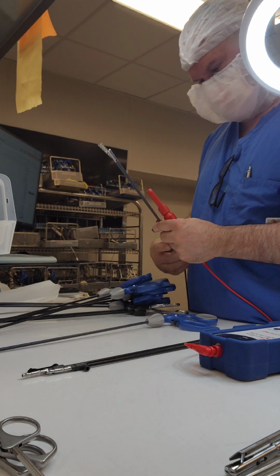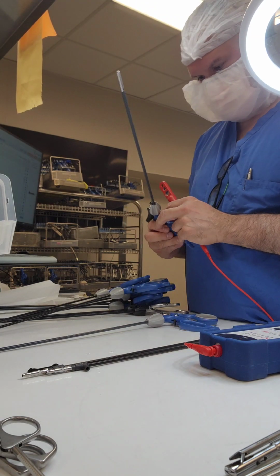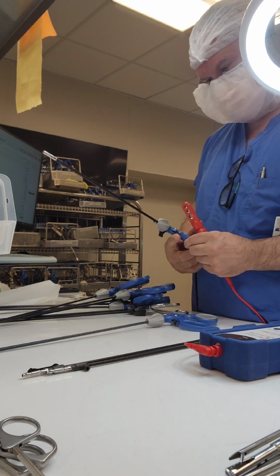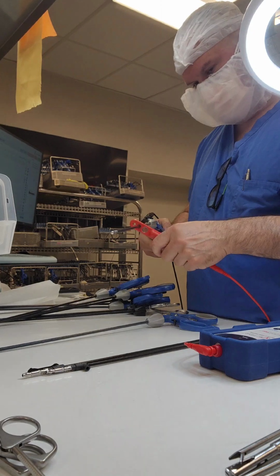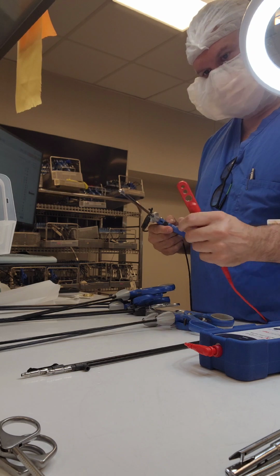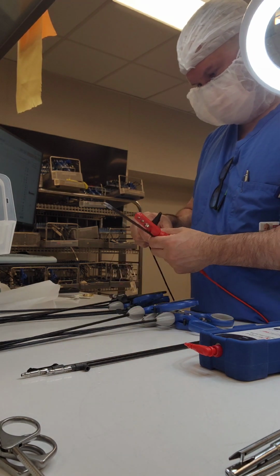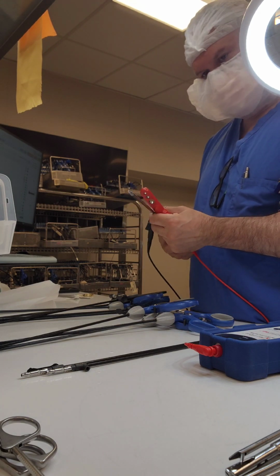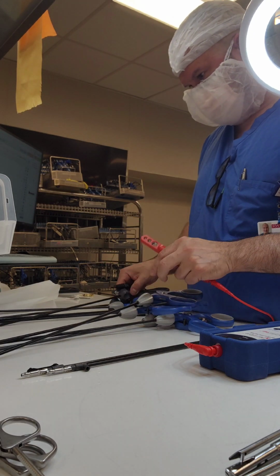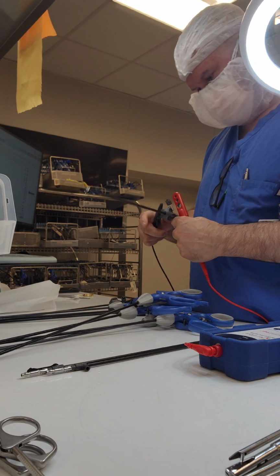I'm continuing there, making sure I close the jaws so that I can place the right millimeters. Now here, I felt something right there in the base. Put that off to the side. That failed, and I'm going to show you what that looks like. And I've had some good conversations with individuals about lap instruments that fail at the base, and they'd be like, well, that part doesn't go into the patient. But the user is exposed to that part. So if a surgeon gets shocked while he's using a lap instrument, let's say he has a fine hole in his glove or a tear in his glove, he's going to be pissed.